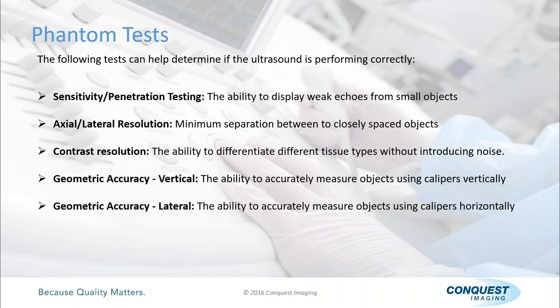I went to Johns Hopkins and taught for a week, and helped them because the engineer there wasn't ultrasound trained. One of the things they wanted me to do was a PM, to demonstrate it for him so that we could do further PMs and let them do it while he had somebody there watching. The system they let me do had 26 probes on it. It's a personal record. It was ridiculous, but you have to do every single probe.